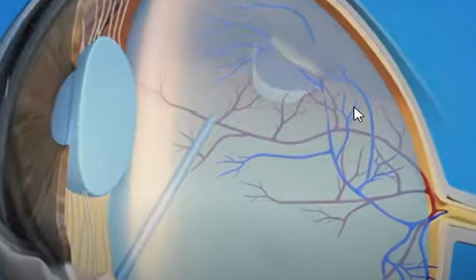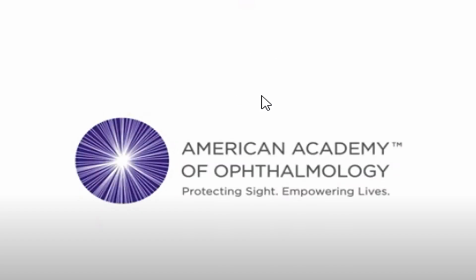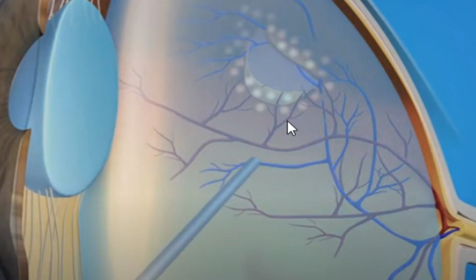and here to be very sure about closing the tear, we also used laser photocoagulation. Okay, and in laser photocoagulation, as I told you, if you can carry out laser photocoagulation for a tear, you should put it as your first option to make sure that it is sealed to avoid any subretinal fluid accumulation or fish mouthing phenomena or whatever.